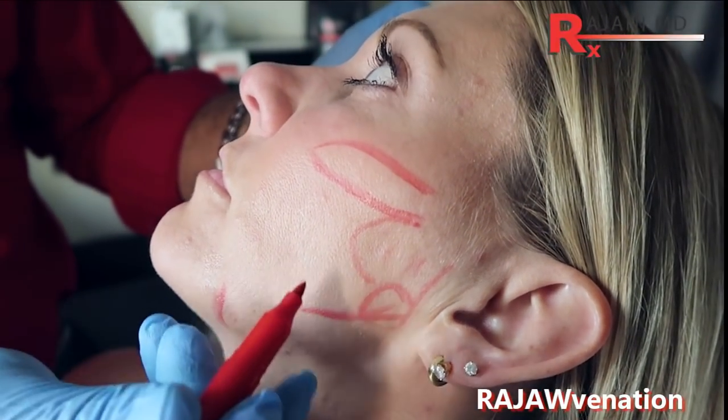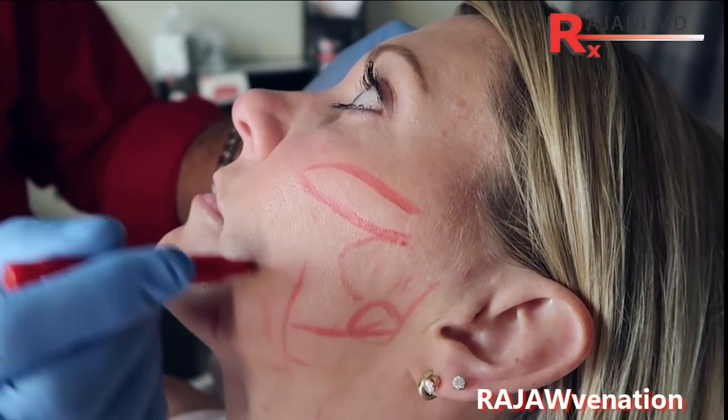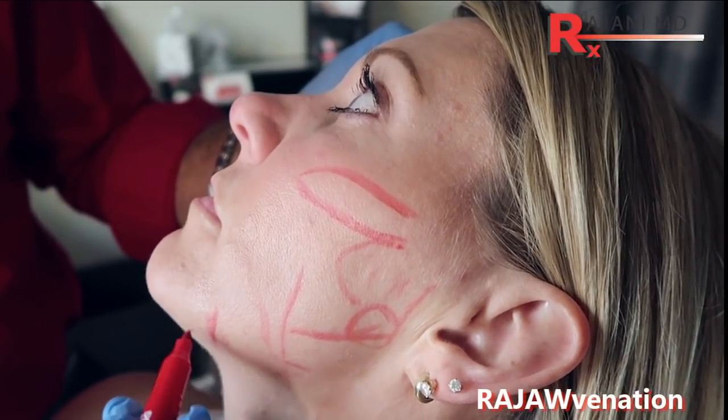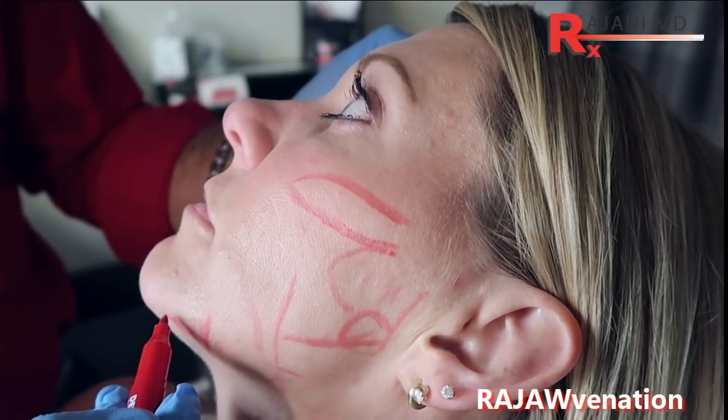Be mindful — bite down for me. In front of the masseter is your facial artery coming up here, but we're superficial to that. You can come in here with the cannula and inject the pre-jowl to straighten that out if needed.